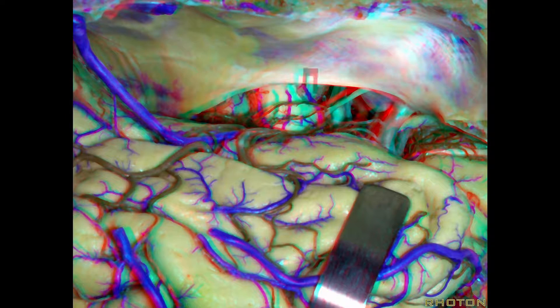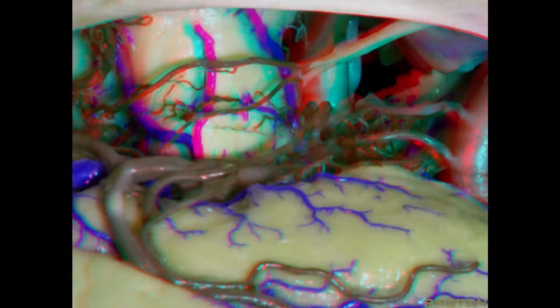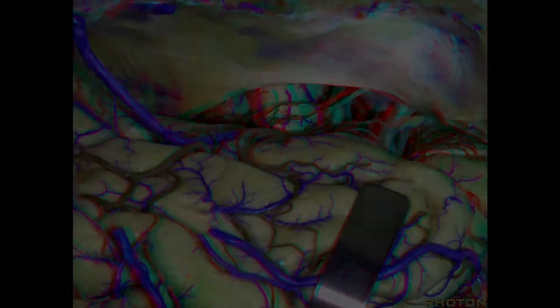It gives us cavernous sinus and middle fossa triangles using the OZ approach. It gives us increased sub-temporal and pre-temporal approach. It allows us to do anterior petrosectomy to expose the anterolateral brain stem. It gives us the transcavernous approach and exposure along the sylvian fissure and access to basal cisterns.